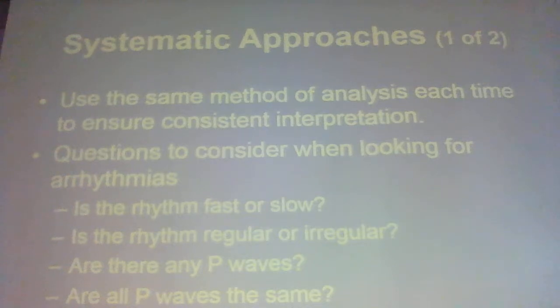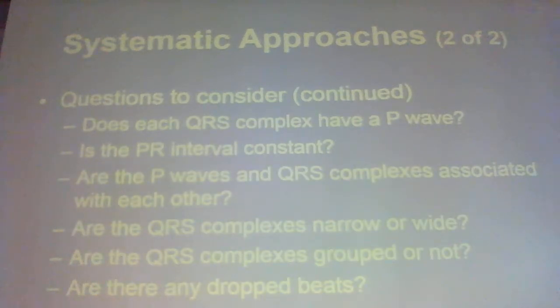All right. We went through all of that stuff. Now, what about this wide or narrow QRS? Why do we care? Bundle branch blocks, what else? Ventricular beats, paced beats, left ventricular hypertrophy, all those things potentially do what? Screw up our ability to see the ST segment, right?